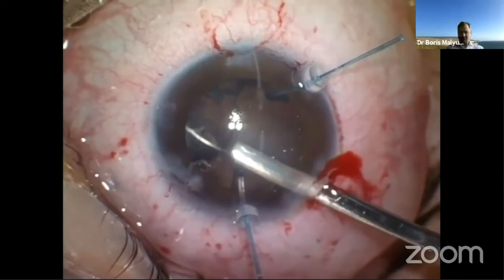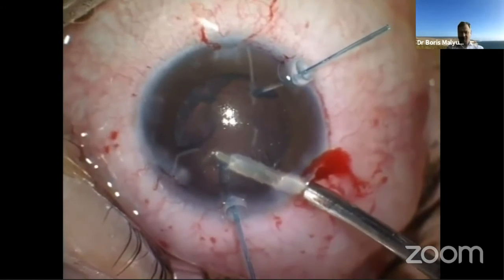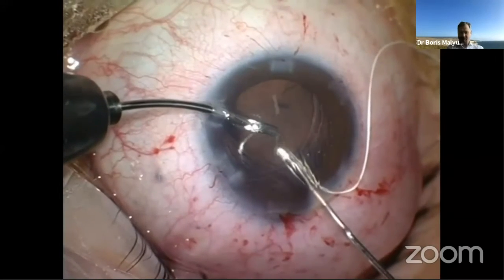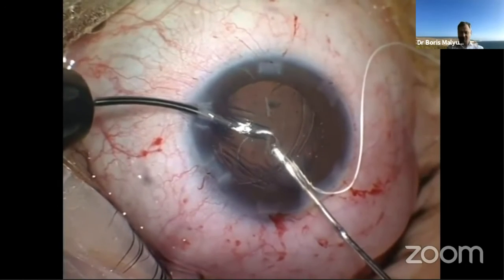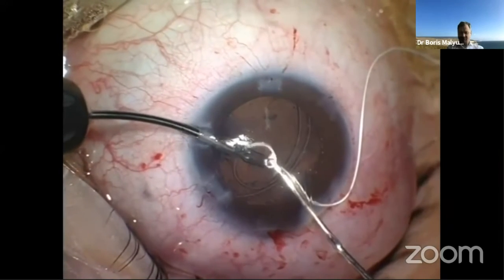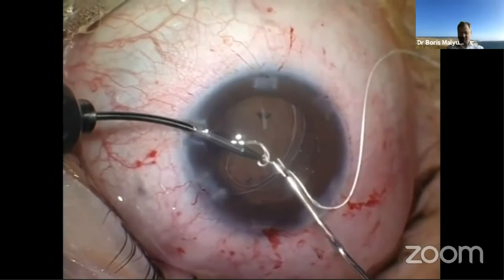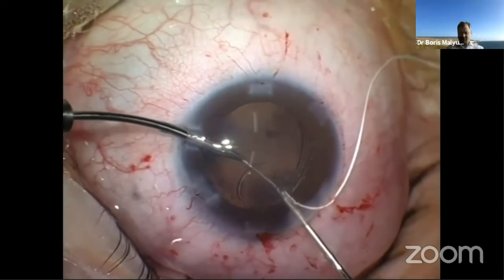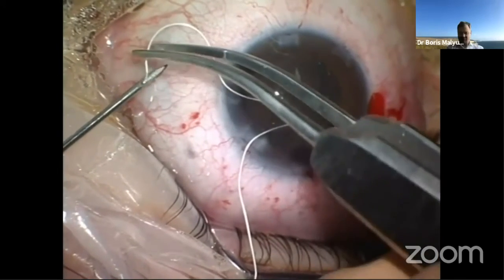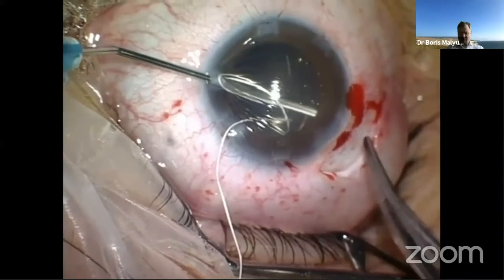In spite of the capsular hooks that are in place, there is still a gap in between them where that issue may happen. I decided to attach the suture to the eyelet of the CTR without doing it outside of the eye. Sometimes it's much more helpful to do it that way. For that purpose, I'm using two 25-gauge forceps. A bent 25-gauge needle will be used to introduce the suture through the ciliary sulcus and go out of the eye through the sclera.